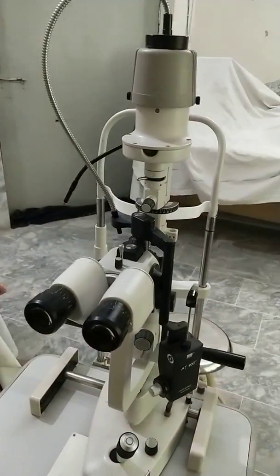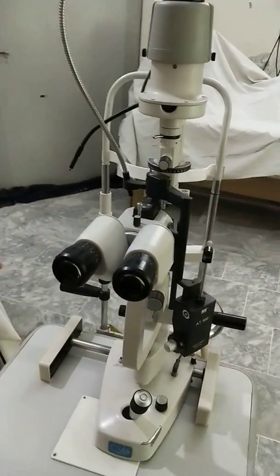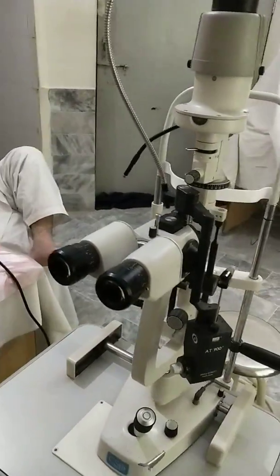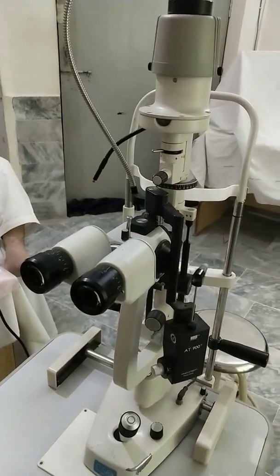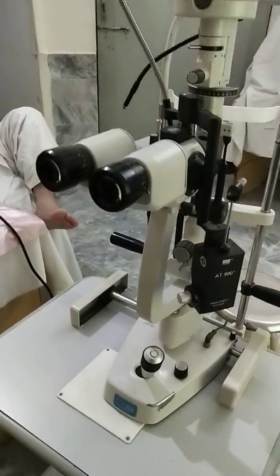Hi everyone, I am Dr. Sharjir and today I would like to demonstrate different parts of the slit lamp.